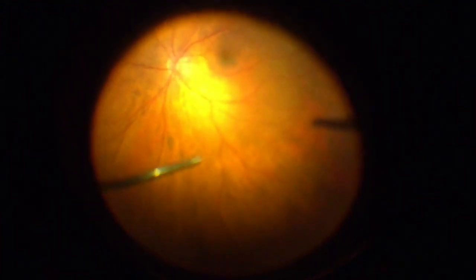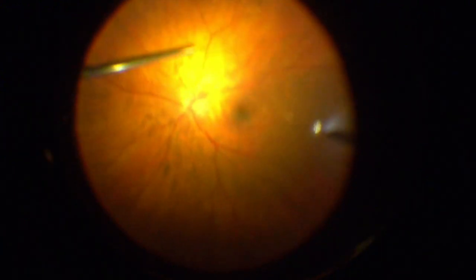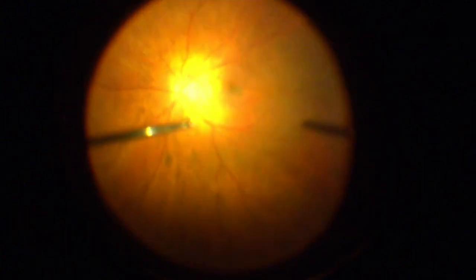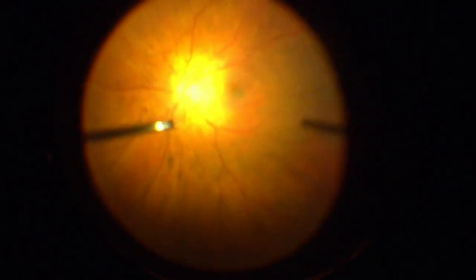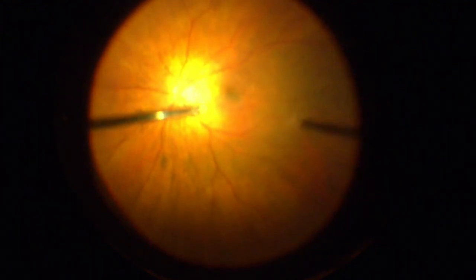You can see the diabetic hemorrhages in the periphery. Another consideration here is to add a little laser at the end of the case. Even though she's not proliferative diabetic retinopathy, a lot of times post-vitrectomy, it's a little hard to judge how patients will progress in their retinopathy. It doesn't hurt to add a little PRP. So I think we'll do that for her, Jenny. Okay, we're going to want endo laser here at the end of the case.